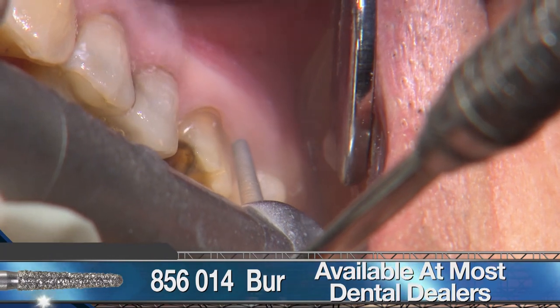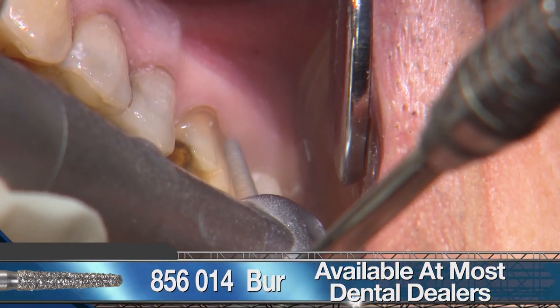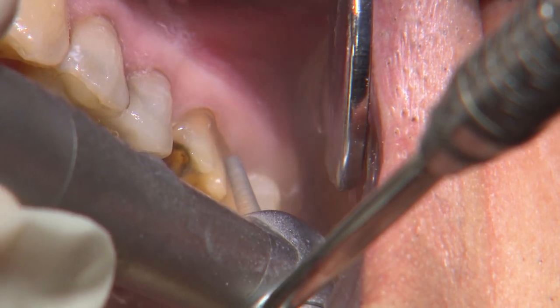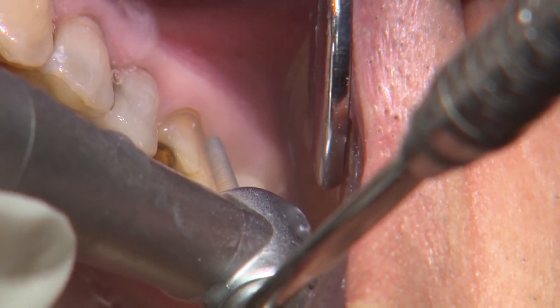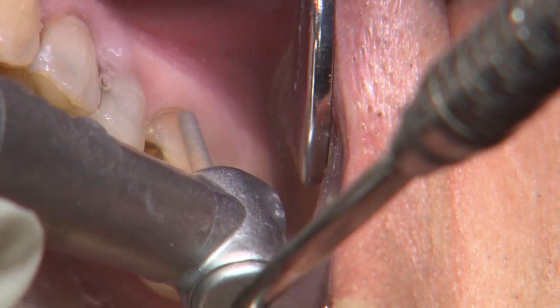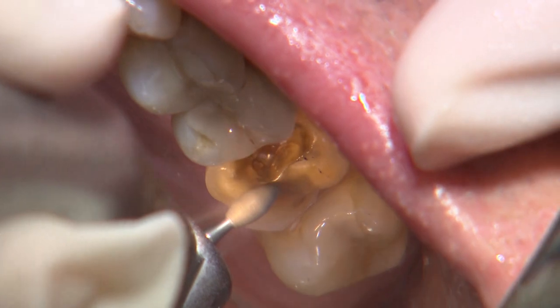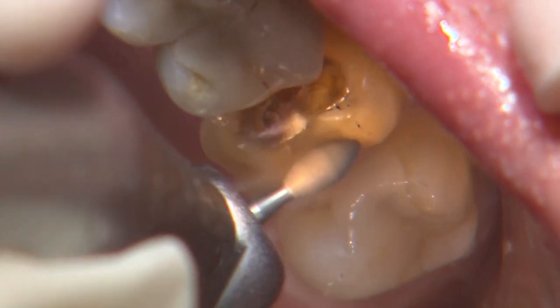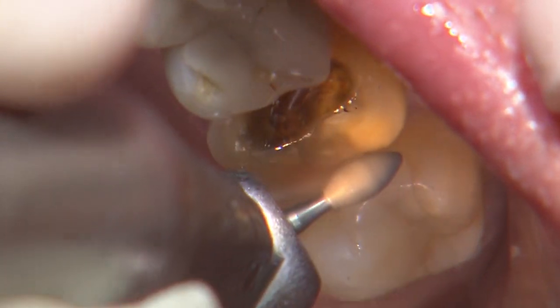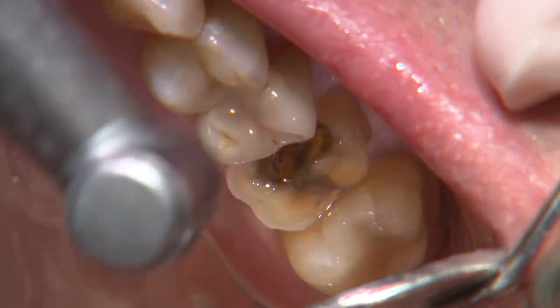I'm using a coarse grit 856014 round-ended tapered diamond bur to reduce the buccal to a depth that blends in with the abfraction and also connects to the finish line of the original prep. When finished making the bulk reduction on the axial and occlusal surfaces, I try to round over the internal line angles with a football or round bur to minimize any internal stress along our restoration.